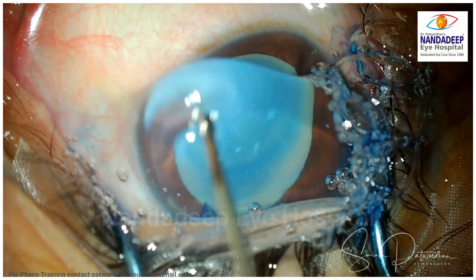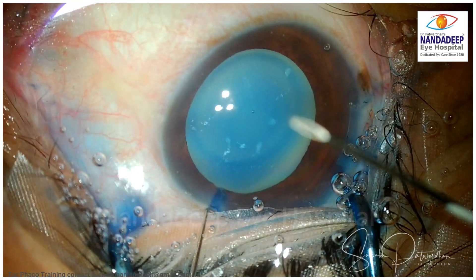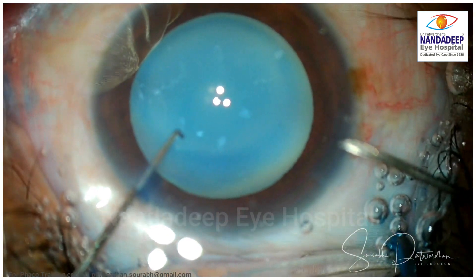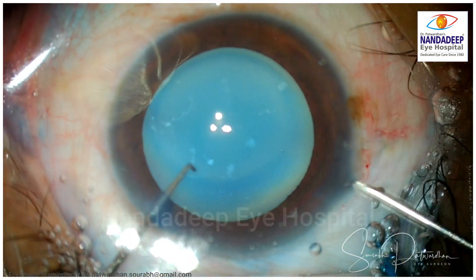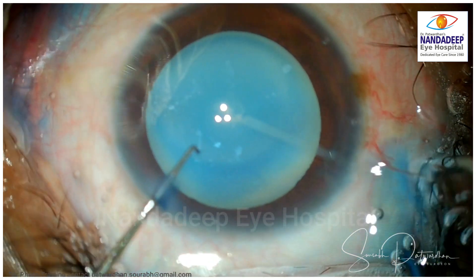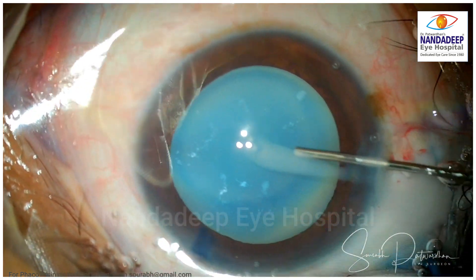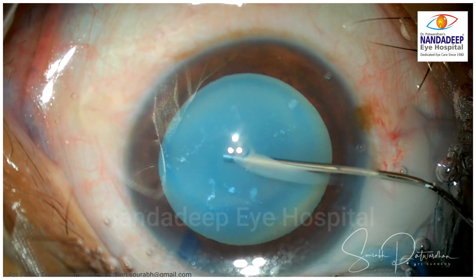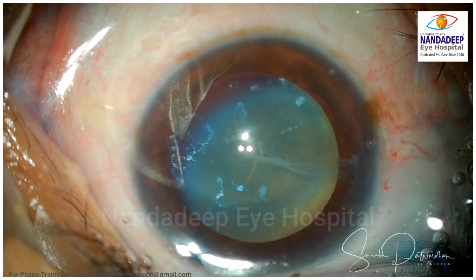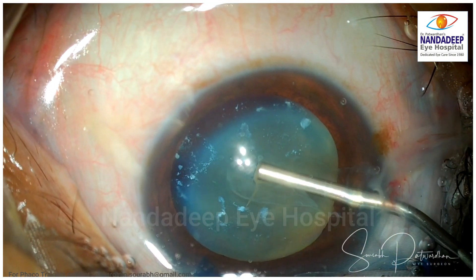Also, the Trypan Blue makes the capsule a little bit brittle. The first nick I am making using a cystitome. Here I will get to know how the zonules are — in Morgagnian cataract we may expect weak zonules. The first nick goes and you can see, as expected, the milky fluid which is the liquefied cortex is coming out, and the cataract will change its color from white to yellowish brown. There is a shrunken nucleus as we expect in this particular case.